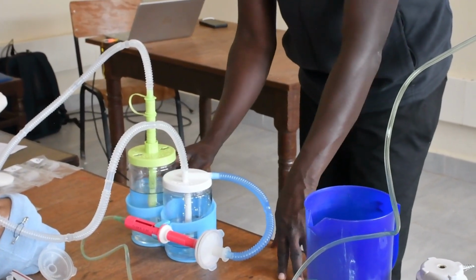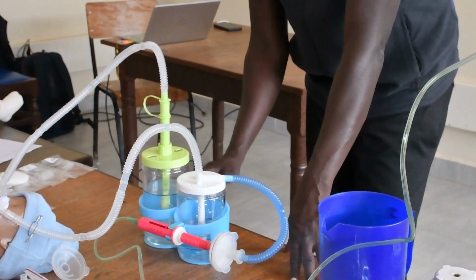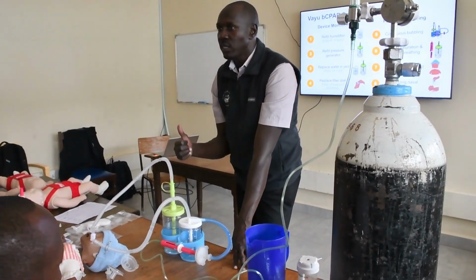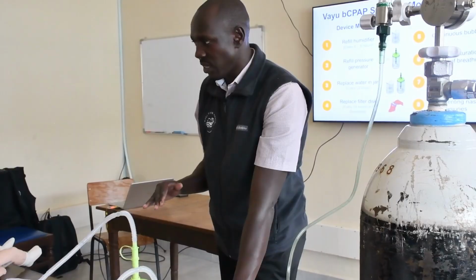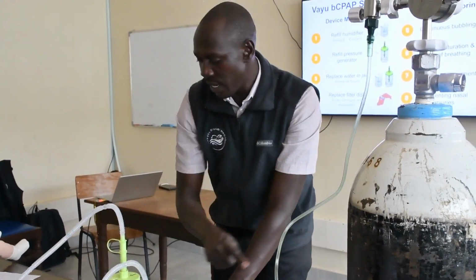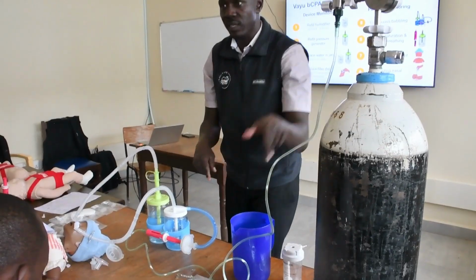Bubbling should be appropriate, continuous bubbling. It should not be intermittent. It should not be vigorous. It should continuously bubble. So this is the device monitoring.